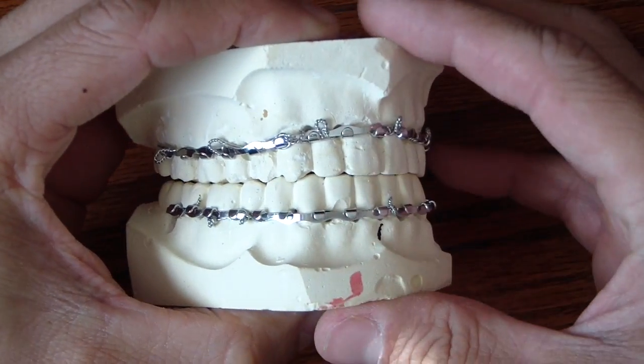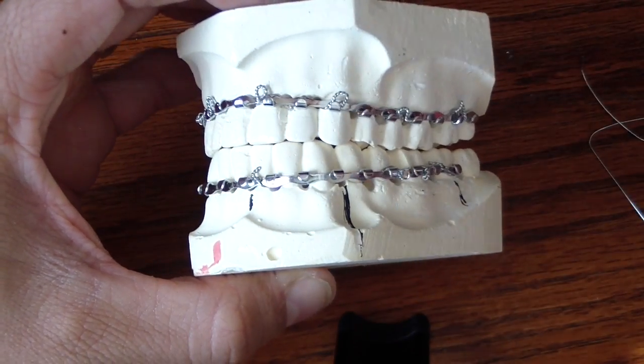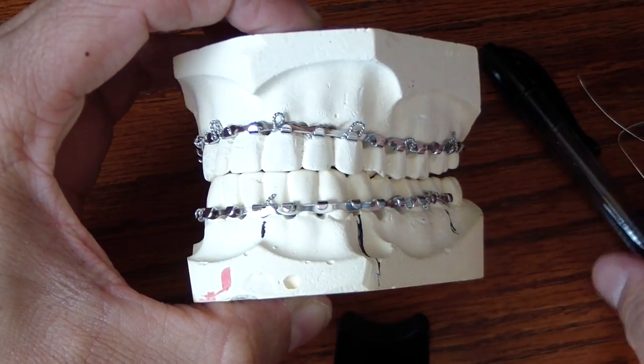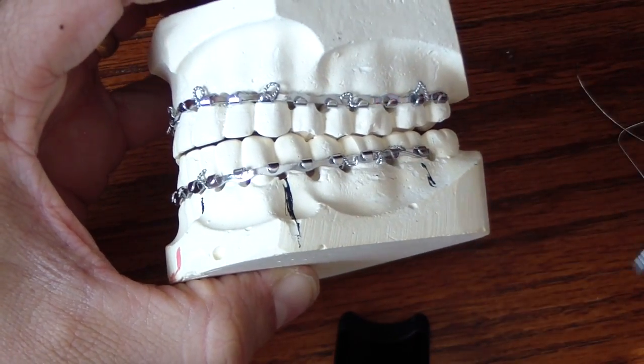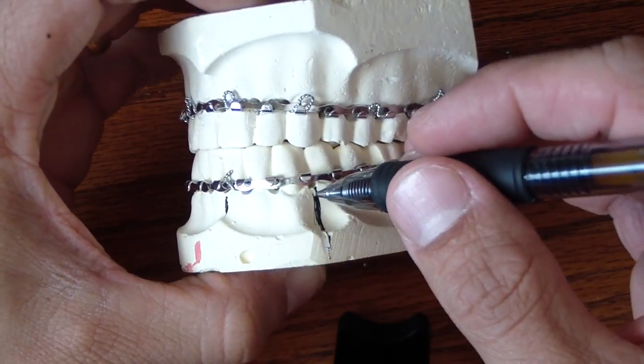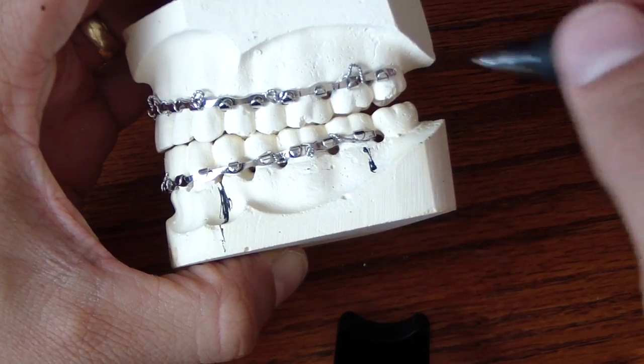This is the final result before we fish loop them together. We have almost every tooth engaged in the arch. The Erich arch bars would be used if you had a mandibular fracture: symphyseal, parasymphyseal, body, angle, or subcondylar.